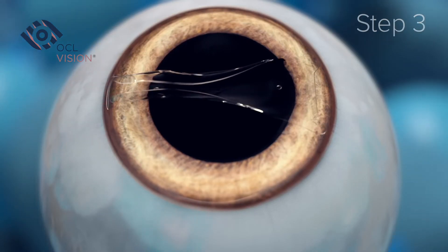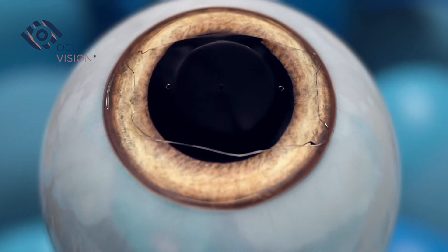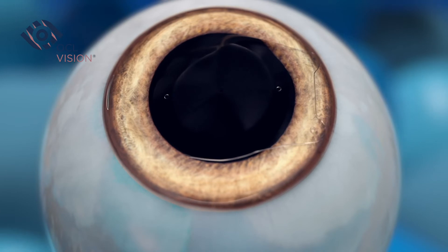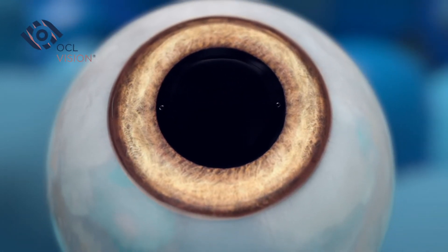Step three: once the EvoICL lens is inserted, the doctor will make any necessary adjustments to ensure its proper positioning in the eye, securely placing it behind the iris, the colored part of the eye, and in front of the natural crystalline lens.